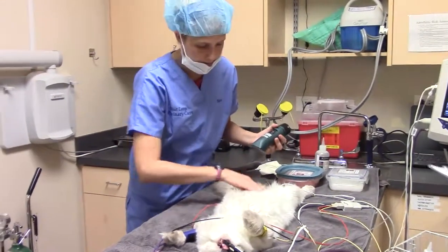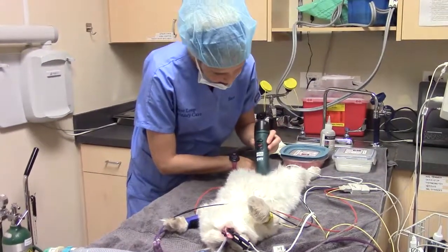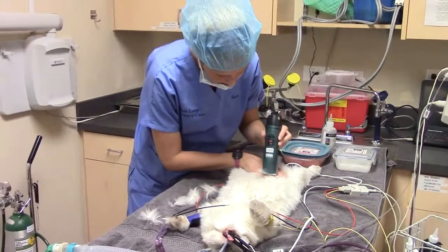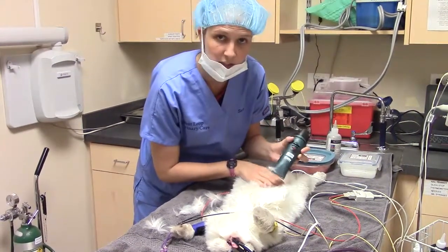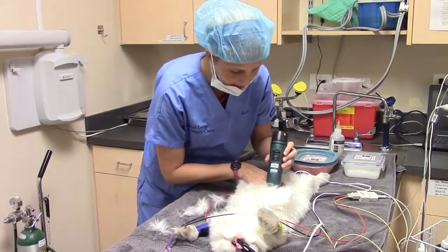This is the xiphoid up here and the pubis down here. You also want to make sure you visualize the umbilicus, and be careful when you're shaving over any of the nipples — you don't want to shave those off, obviously.